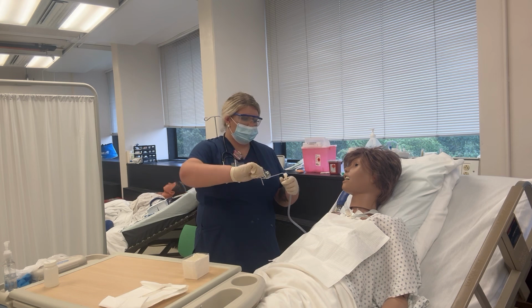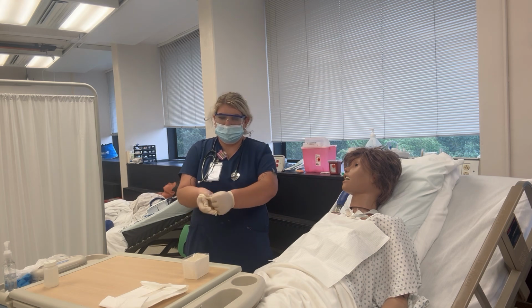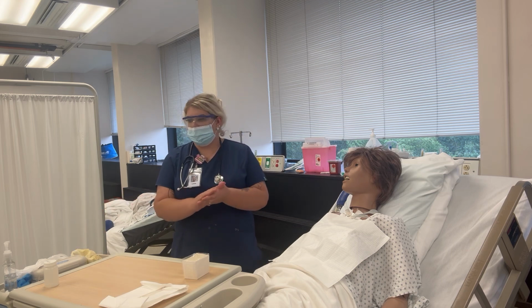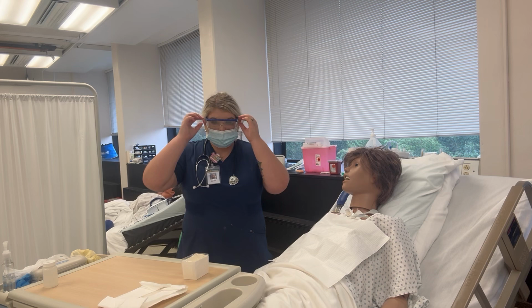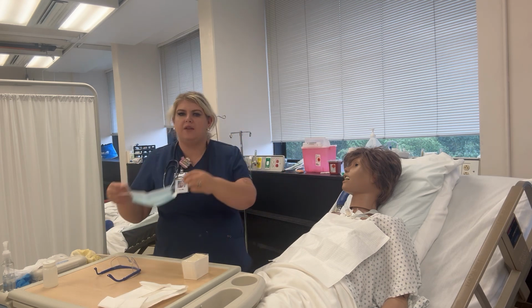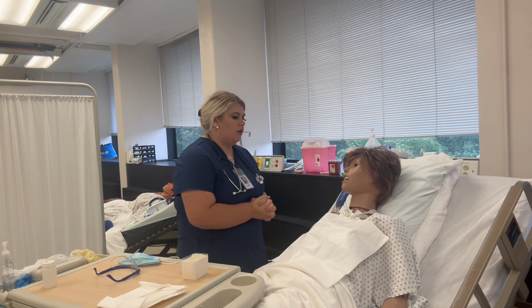So we're going to go ahead and dispose of supplies. We're going to remove gloves. And we're going to do a round of hand hygiene. And then we want to go back and reassess the patient. We're going to look for, again, their rate, effort, if their O2 is still okay, their respirations are okay, and their lung sounds, if they don't sound as congested.